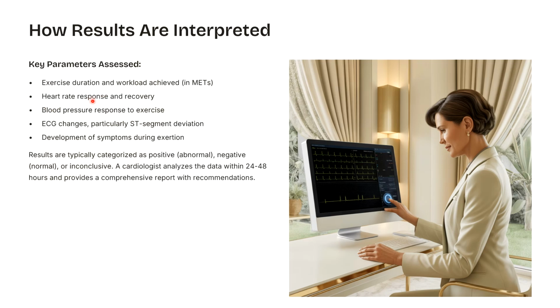Next, heart rate response and recovery: what was the pre-exercise heart rate, the heart rate before exercise, and how the heart performed during the exercise, whether the heart rate increased according to the increment of the workload. Then within how much time the person recovers their heart rate, because it is very essential. The quicker the recovery, the stronger the heart is. Next, blood pressure responses to exercise.